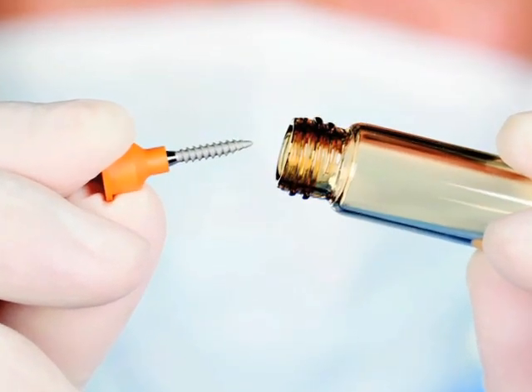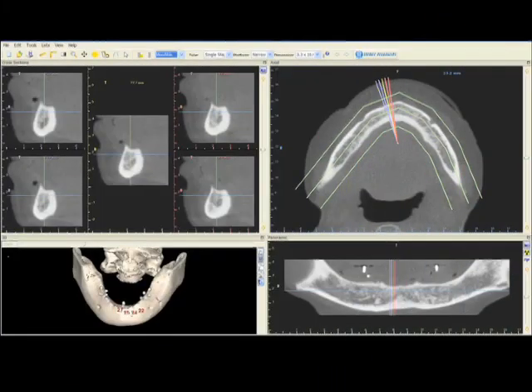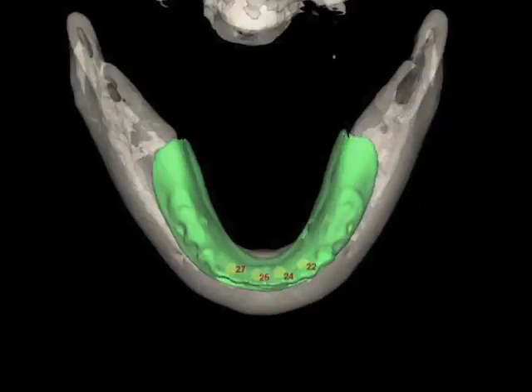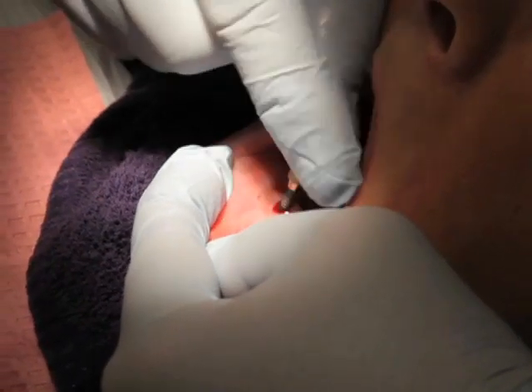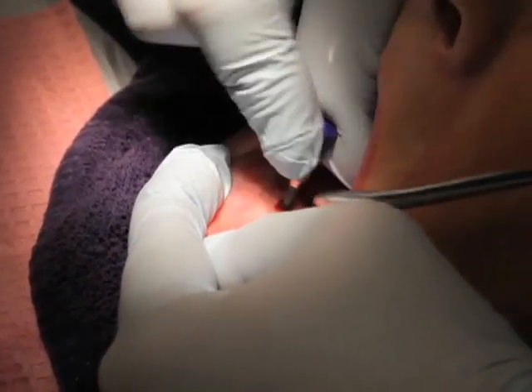Implant dentistry is undergoing some amazing transformations today. With the help of CT diagnosis and digital treatment planning, general dentists can predictably surgically place and restore many different designs of dental implants to improve the quality of life of their patients. Innovations in design and materials have made our job as clinicians less complicated and more successful than ever before. Implant dentistry has entered into the mainstream mindset as well, with many patients asking about the benefits of dental implants.